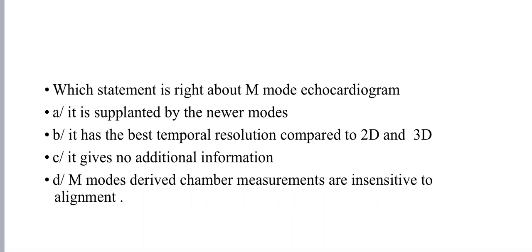I think B is right. And the M mode has good temporal resolution. Is it better than 2D and 3D? I don't know if it's better or not. You are not so sure. Okay. Yeah. Any other opinion? Yes.